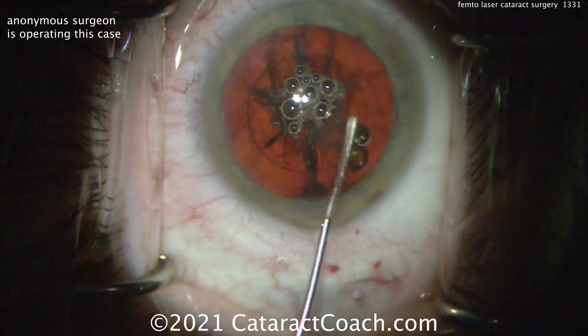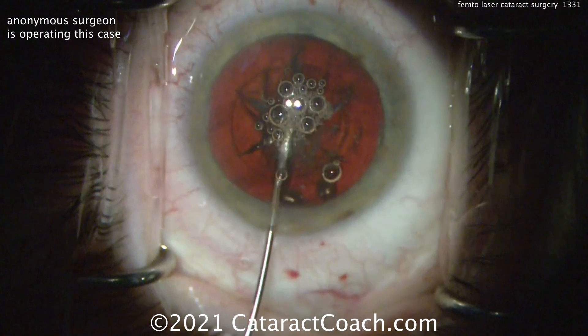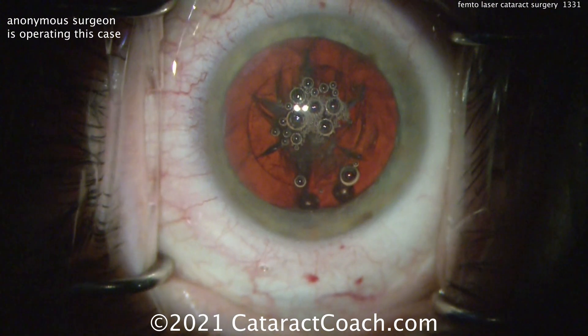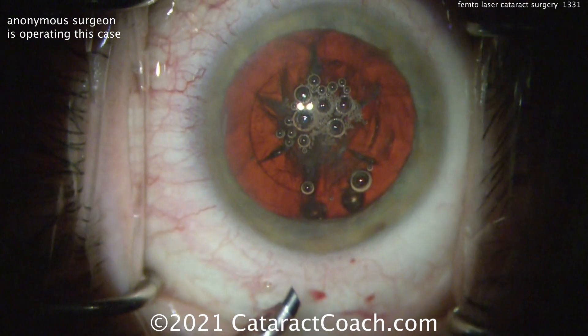You can see good fluid waves going across here. Since the nucleus has already been divided into six pieces, it's going to be relatively easy to get those pieces up and out of the eye. No need to do any chopping, no divide and conquer — none of those methods.